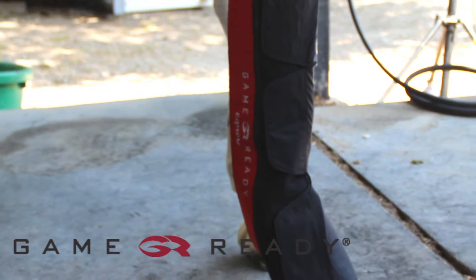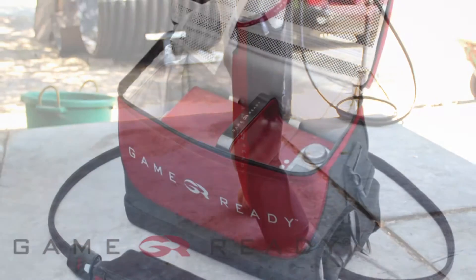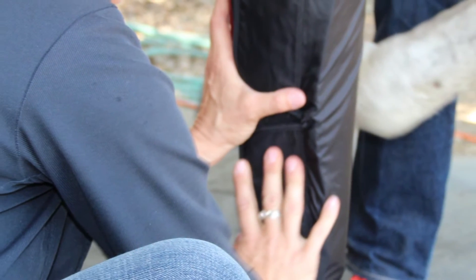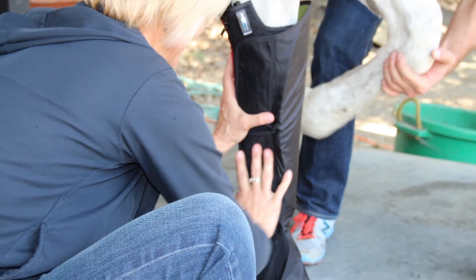Welcome to the GameReady Equine Full Leg Wrap application video. GameReady uses Axel technology to apply cold and active pneumatic compression therapy designed to help your horse recover from injury or surgery as quickly as possible. This video will demonstrate how to apply the Equine Full Leg Wrap.